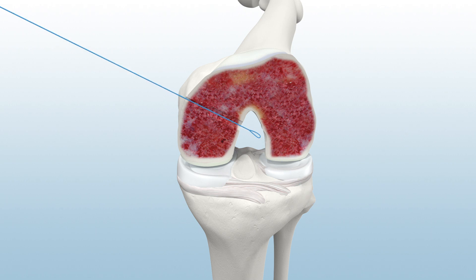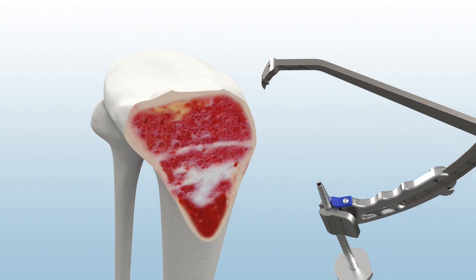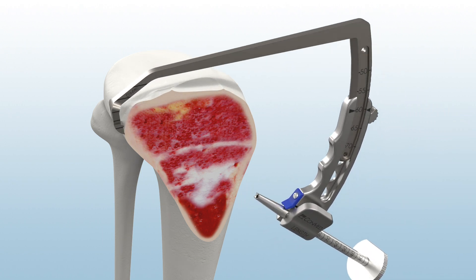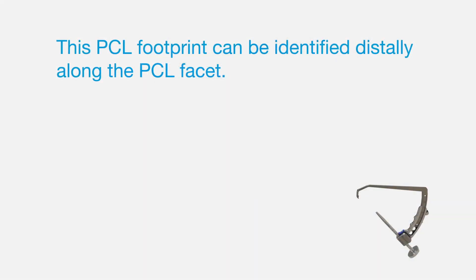For tibial reaming, assemble the Infinity Modular Guide System using the tibial PCL guide arm and the 2.4 mm guide sleeve. Insert the guide arm through the anteromedial portal and place the pin capture of the guide arm over the tibial footprint. This PCL footprint can be identified distally along the PCL facet.